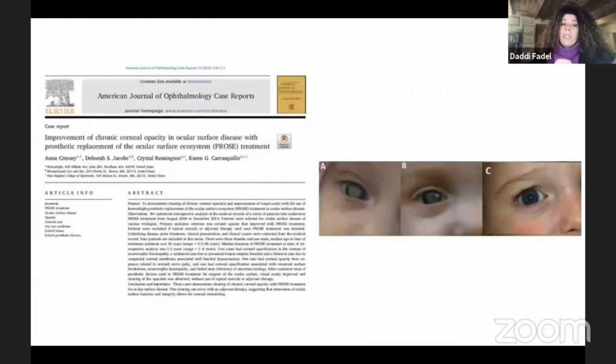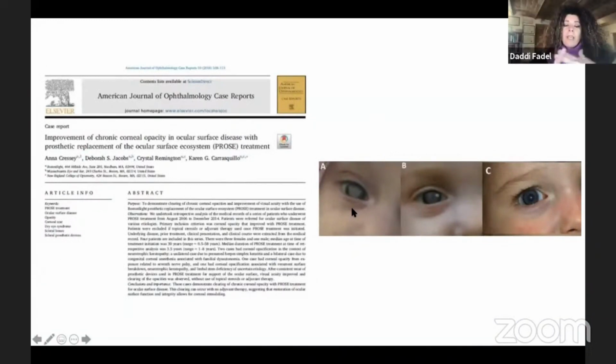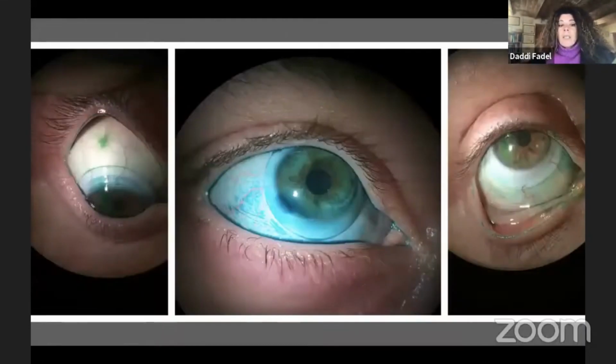This case is very interesting because it showed that it's possible for corneal opacities to resolve with daily wearing of scleral lenses without the aid of other treatments. The key here is again to avoid tight-fitting limbal compression and fit a well-aligned lens on the conjunctiva. Scleral lenses in dry eye are indicated as they protect the ocular surface.